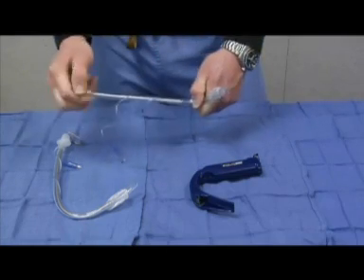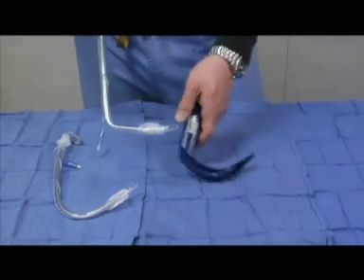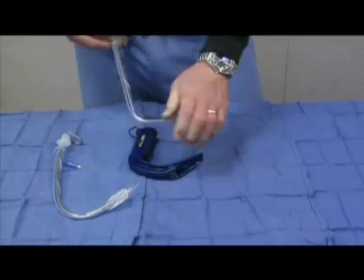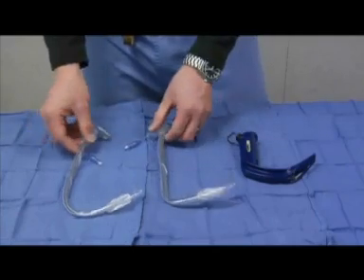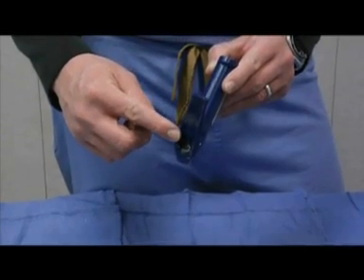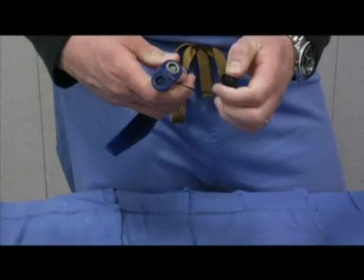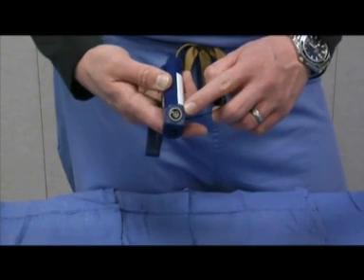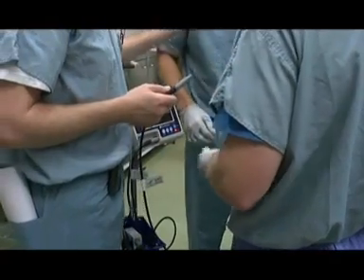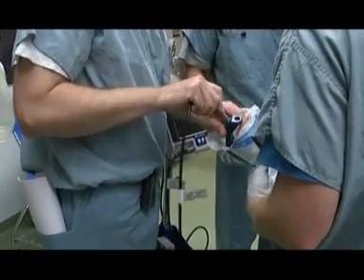An additional option, not available at the University of Kansas Medical Center, is a reusable Glidescope-specific stylet supplied by Verathon. The novice user may gain experience with this at outside institutions. Note the recessed camera, which protects it from airway secretions and the effects of lens fogging. Also of note is the four-pronged connector port, which relays the video signal to the monitor. Just prior to intubation, the Glidescope is appropriately connected to the monitor.